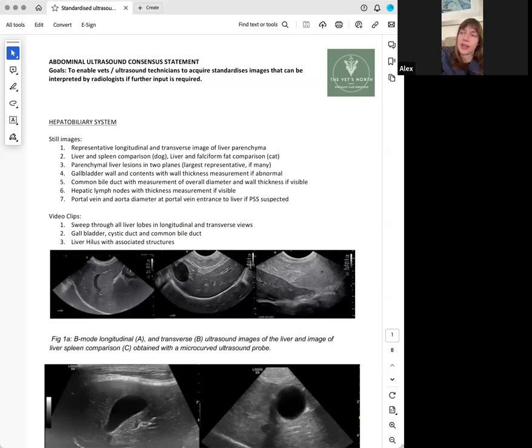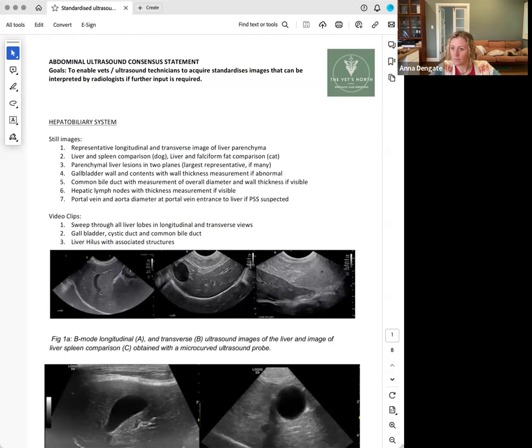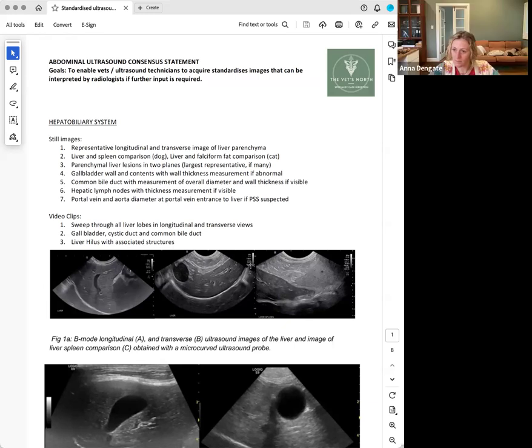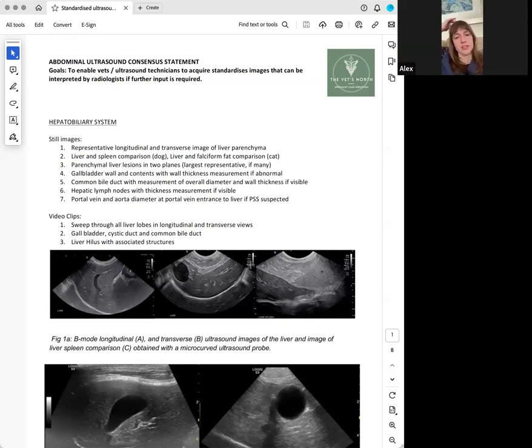And also how it relates to other anatomy. So in a big dog, I often find I have to push quite hard to find the right kidney. But if it's suddenly really easy to see, or the pyloduodenal junction's a lot more in the abdomen because the liver's pushing it, then those are other things that I look at. So how it relates to anatomy that it normally touches and where that is in the abdomen as well.